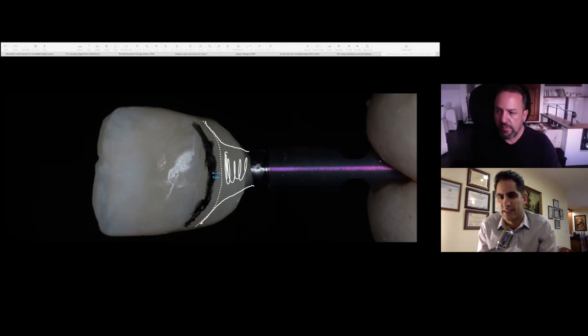Go ahead. There's one thing that's absolutely critical when we are replacing the provisional with a final crown. It is absolutely imperative that some kind of individualized impression post is made. And it is also imperative that the technician understands that they also have to have a try-in model of just stone, so that they can work on a normal model, but they have to have a stone model to make sure that when they transfer the permanent crown, they haven't changed the contour one smidgen, even a little bit, okay?